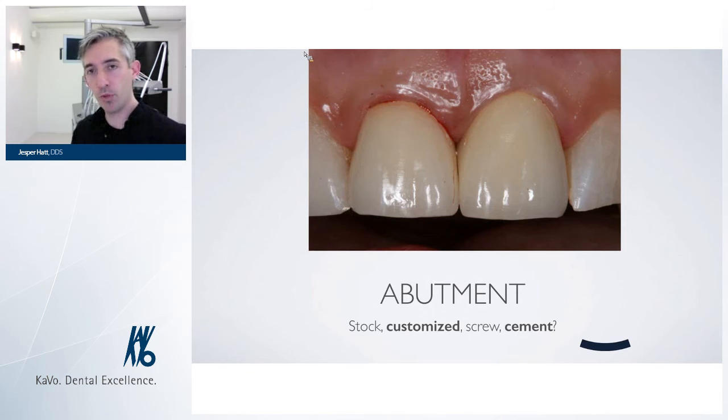So this way we get a nice aesthetic result, and we get a hemidesmosome attachment of the soft tissue to the zirconia, which I also happen to like. Usually when we see problems in regards to periimplantitis, when the hygiene is good, when we take a look at the function, that's usually where we have the problem. Usually we have some kind of parafunction on the crown, and that's why we lose bone around the implant. So always check for parafunction on peri-implant patients.